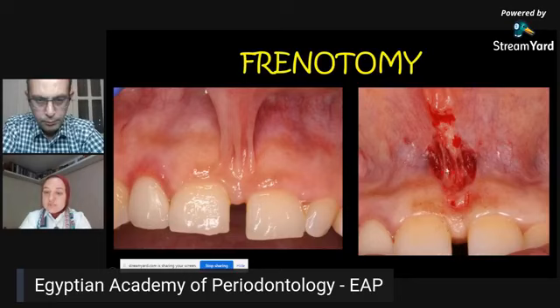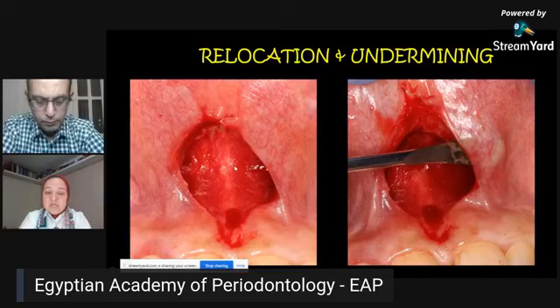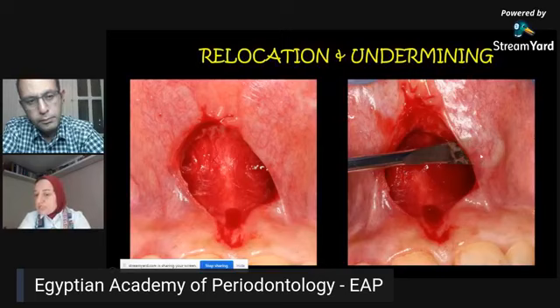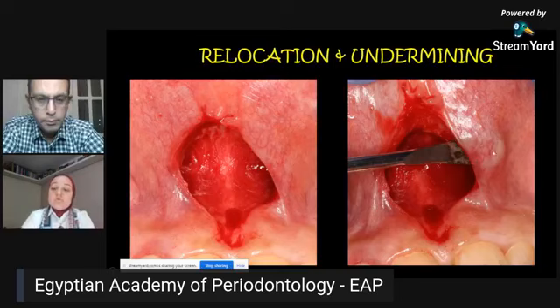Then we go for blunt dissection. We get the periosteal elevator, and we start to relocate this muscle to an apical level, push this muscle more apically, until you get this. Here, you cannot see the strong muscle attachments that we had when we began the surgery. And then you go for a step called undermining, also with blunt dissection, which denotes separation of the overlying epithelium from the underlying connective tissue or labial mucosa, in order to be able to suture without tension with the lip movement to avoid the tearing of the sutures.